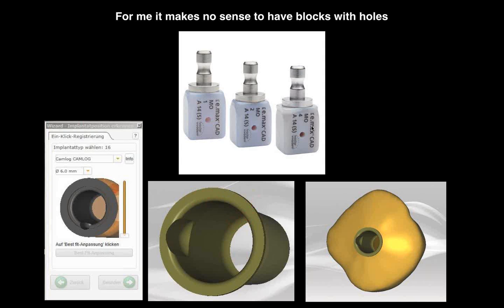Because if you're using an MCXL, you can also mill a lower anterior crown. A lower anterior crown also has a very small hole, and you can mill it. So for me, CEREC mills very accurately, and I could mill something like this if the design has been calculated, put into the crown, into the abutment like you see here, and then my machine can very nicely mill it.